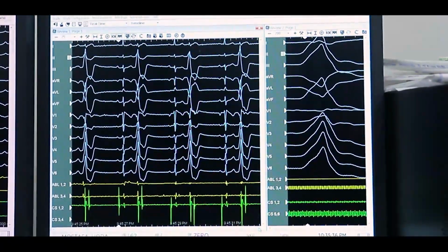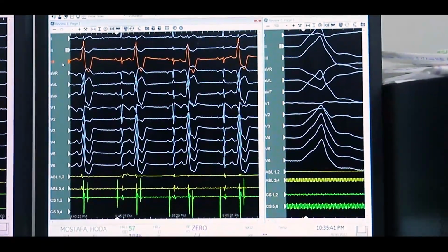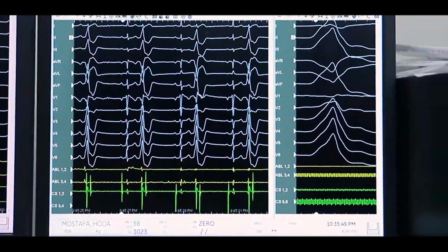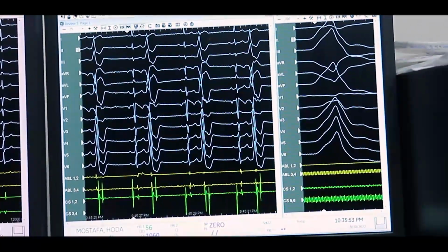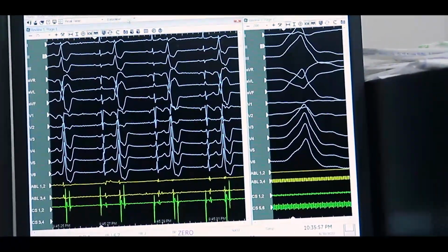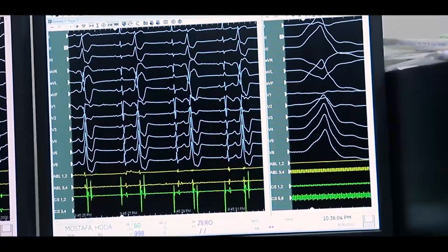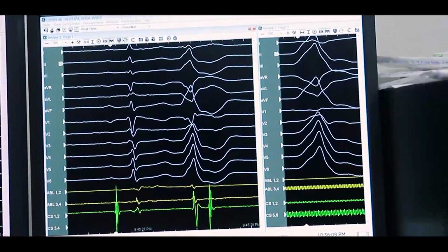When we advanced the CS catheter to the distal CS, first Anwar went to map within the left coronary cusp, but we could not get good numbers. It was still only 10 to 15 milliseconds earlier, which was not satisfactory. We mapped above the cusp and just below the cusp, the right coronary cusp, the left coronary cusp, and the junction between the left and the right coronary cusp. The earliest signal was 11 milliseconds preceding the QRS.